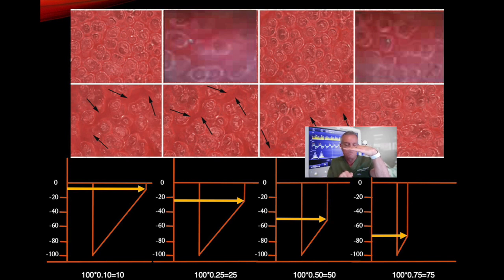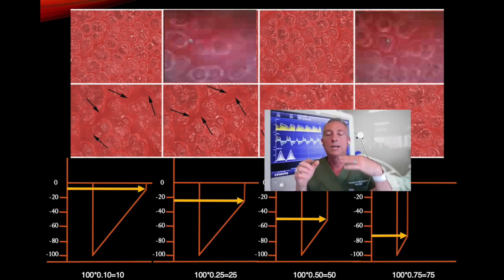That will become, let's say, 60 liters per minute, 80 liters per minute. That becomes your 100%. So that means that on your way back, you don't want to reach baseline because that is zero gas trapping. What you want to do is create this elbow at 50%. If I have 80 liters per minute, when I move my cursor to this point, where does it need to be? 40 liters per minute. That's exactly where I indicate that this is adequate.